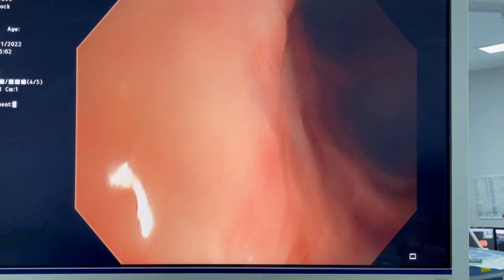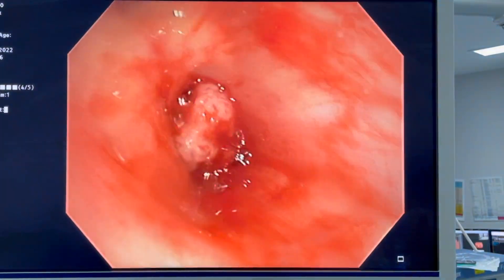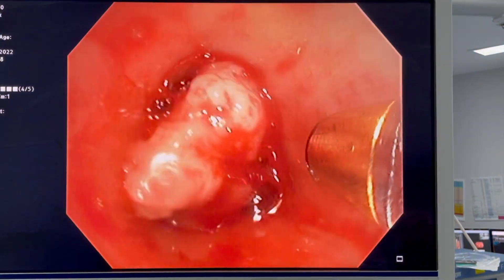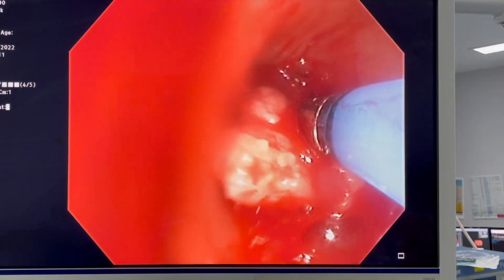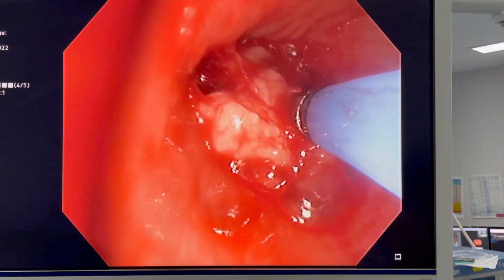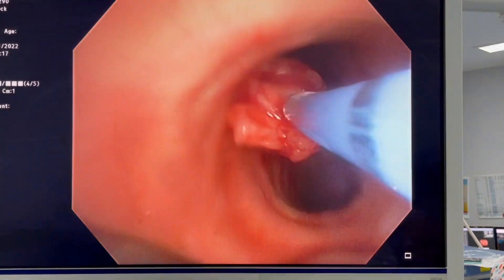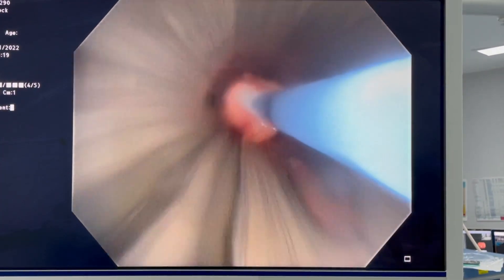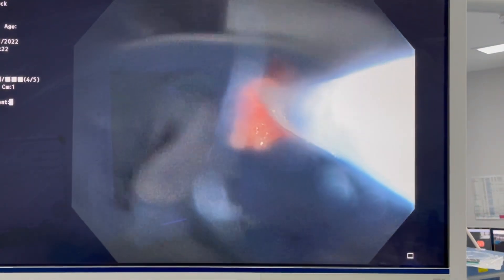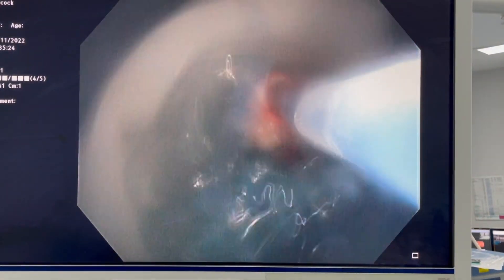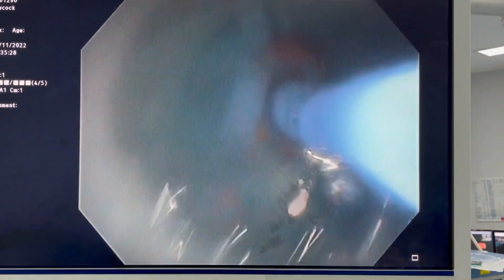Now I'll go back to the lesion which has been resected and I'll use a cryoprobe to grab onto the tumour, which should now come free. The cryoprobe sticks to it — it freezes very quickly. You can see it freeze now; it sticks to the tumour and then I can remove it out through the rigid bronchoscope. That's a really nice way to remove a large portion of that tumour. We'll just put it into formalin so we can send it off for pathology.